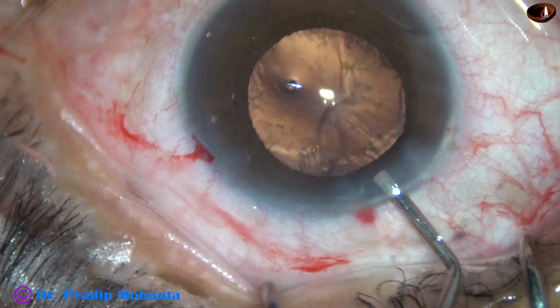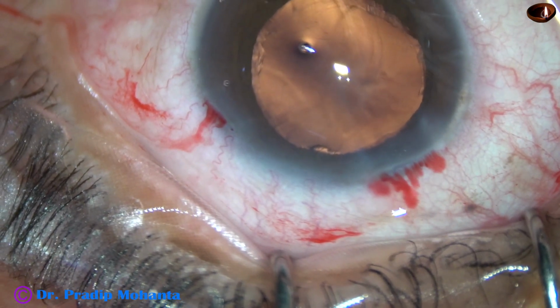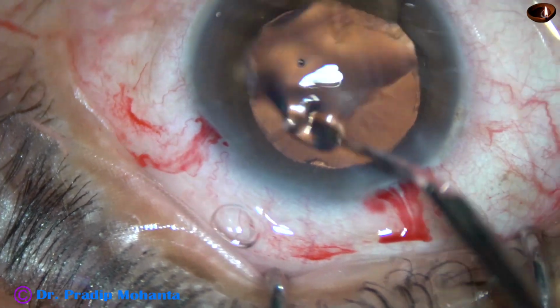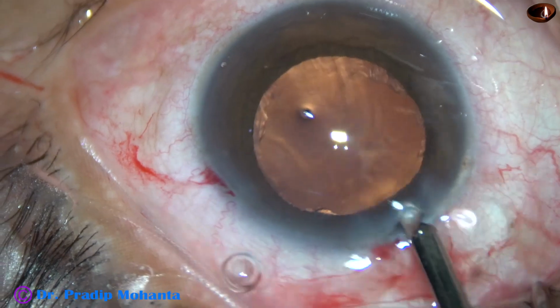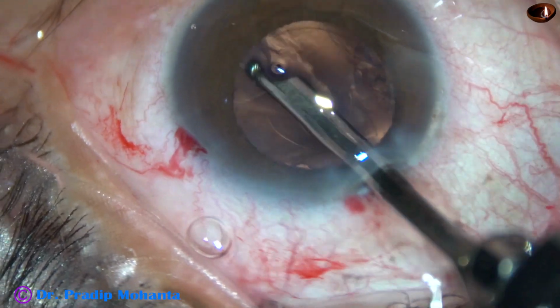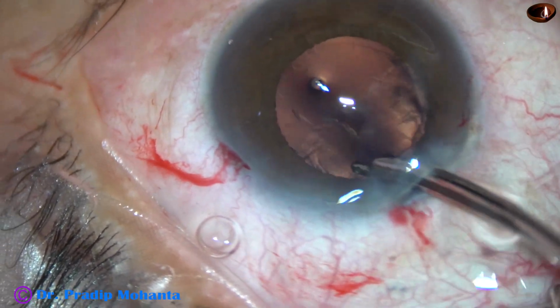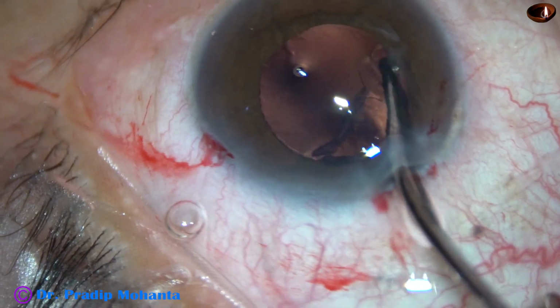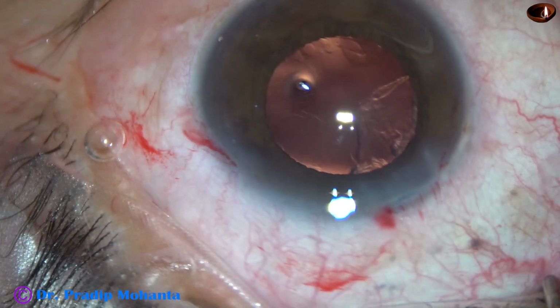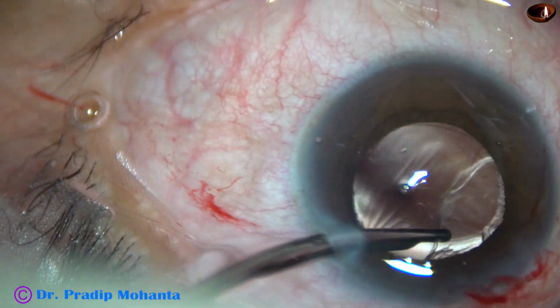And now visco again, and the cortex is to be cleaned. I take a 23G Simcoe cannula for removal of the cortex. See how beautifully it comes out with this very simple instrument. It's almost done. And now the other half.